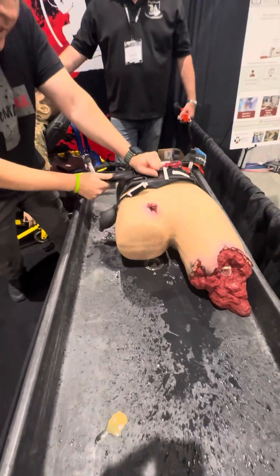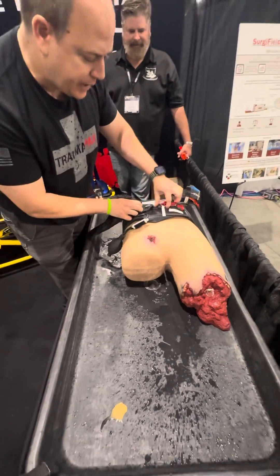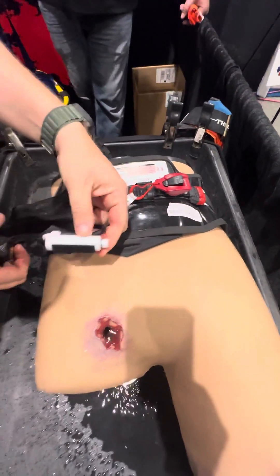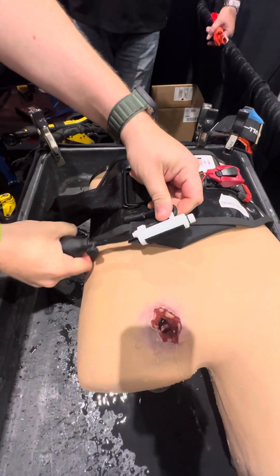I pull this kind of like a traditional tourniquet — high and tight — but here I'm just pulling tight. Now I'm going to use this mechanism to get it nice and snug. Don't need to go super tight.